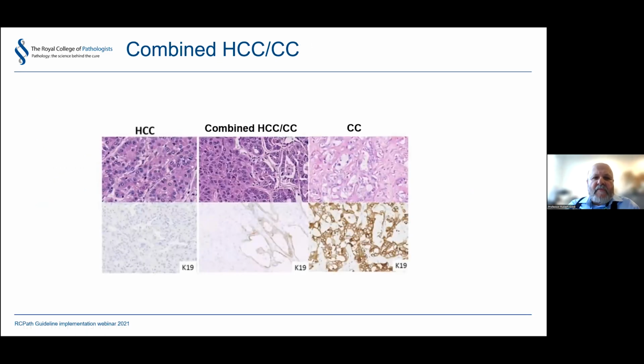We're going to talk about combined tumors now. This is really an overlap between the previous talk and my bit. So liver HCCs we've heard about. We say that they're normally cytokeratin-19 negative, but that of course is not true in a significant number of cases, in which CK19 in classic HCCs may carry prognostic significance. I'll come back to that. Cholangiocarcinomas, of course, are almost always CK19, or more correctly K19, positive.